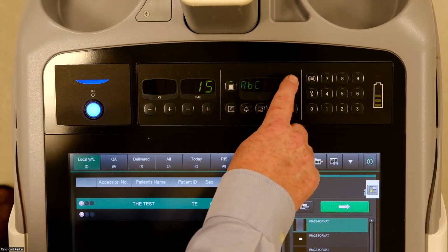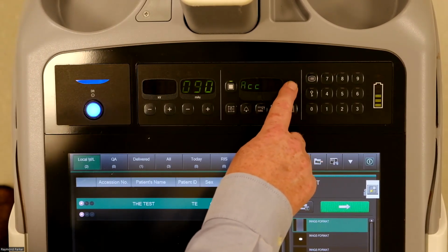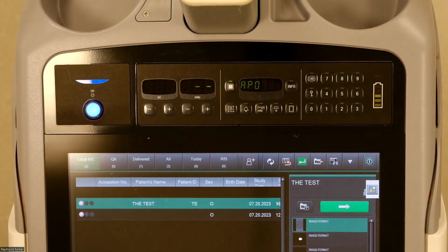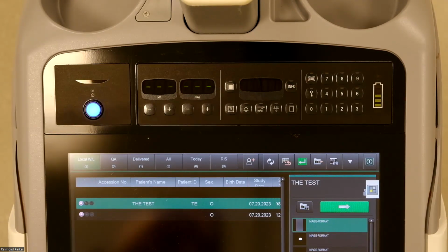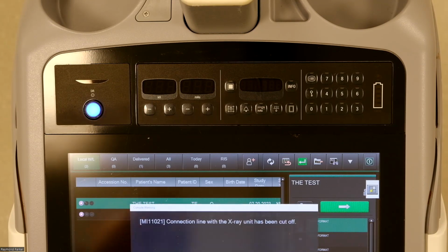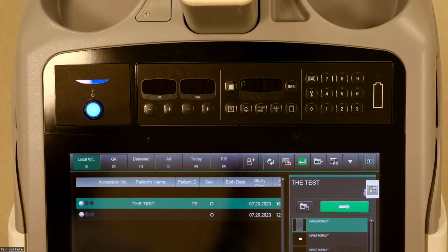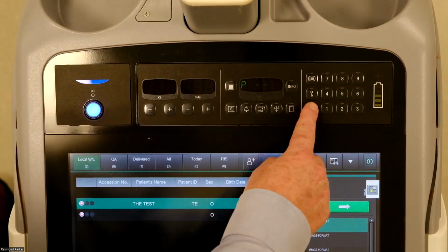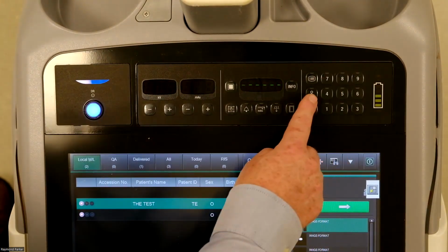I will go through a few of these, but you'll notice that certain user settings are not available with the general user entry PID. To enter the complete user settings selections, you would have to enter in with a more powerful PID, and that number is 001875.